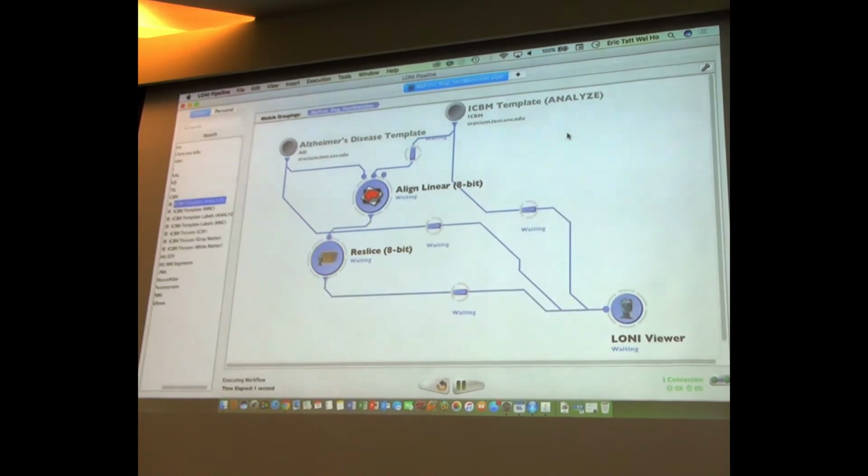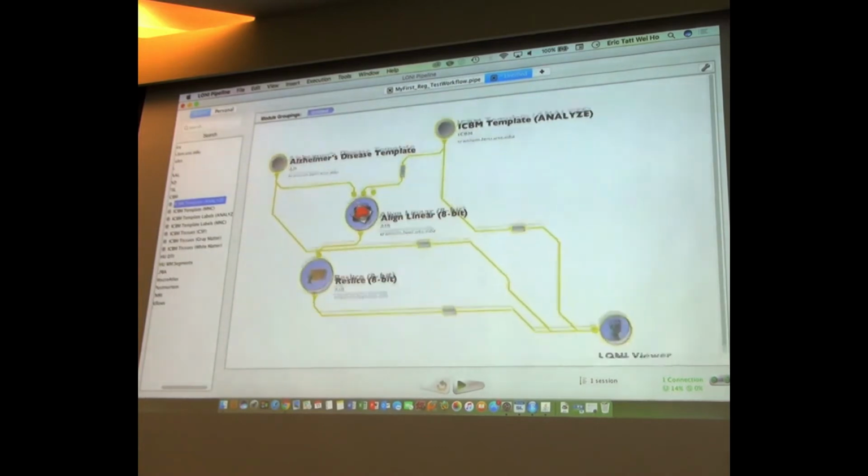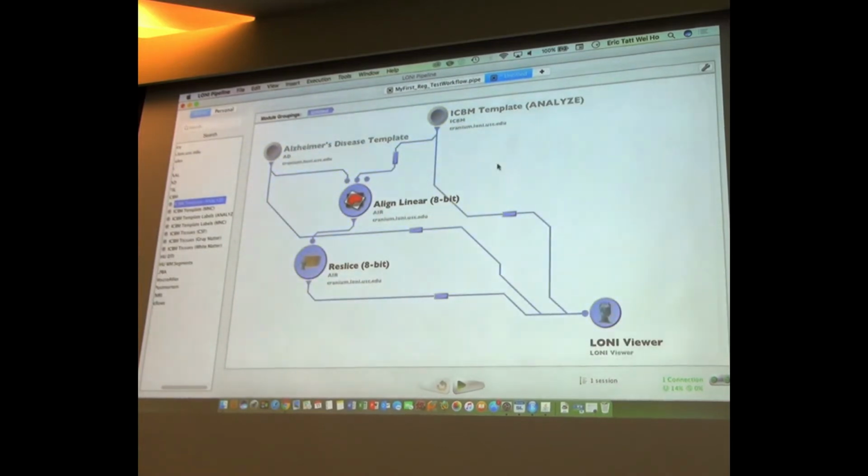Now, by the way, while this is running, okay, it doesn't let me edit it, but you can put metadata about this workflow in the workflow properties, which is not a bad idea, especially if you have the intent of sharing this workflow with somebody. While this is computing, let me just grab the same workflow, Control A, Control C, open a new workflow, paste them in, and annotate a little bit so I can say workflow properties.